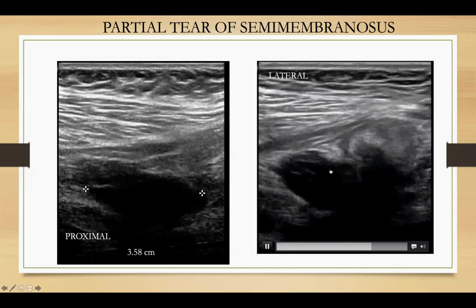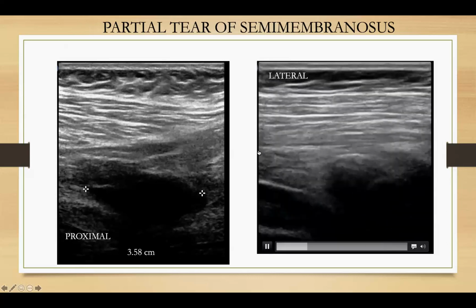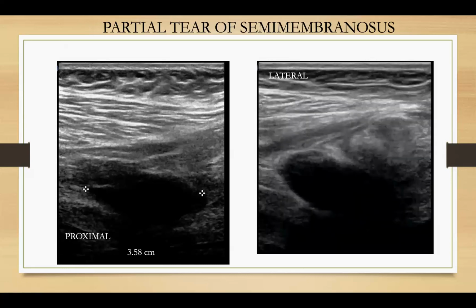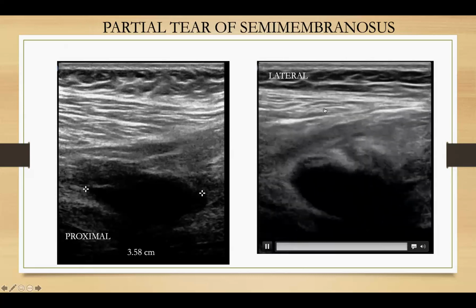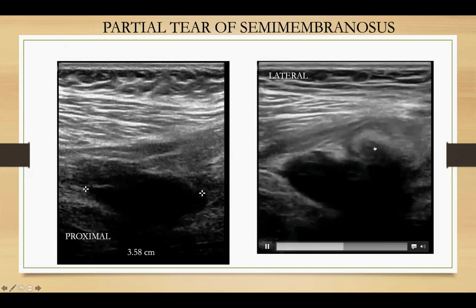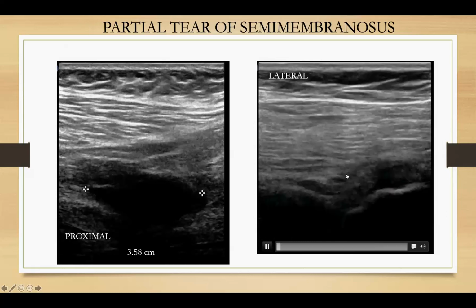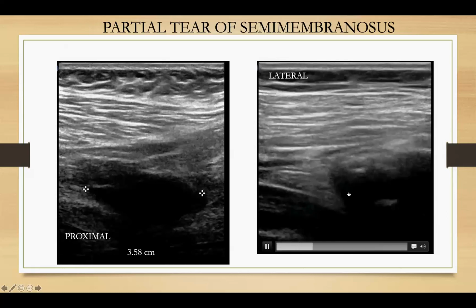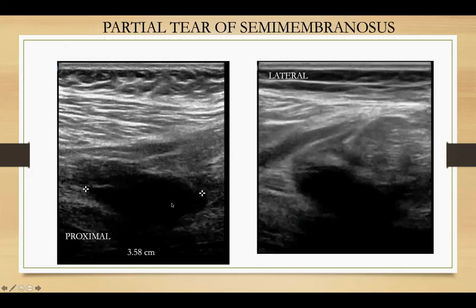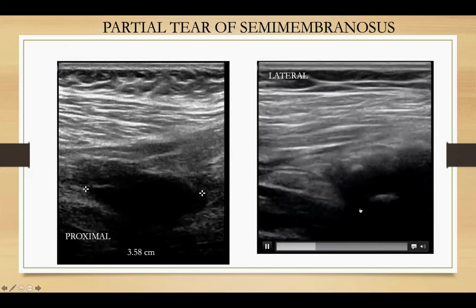This is the video of that. This is a short axis scan. Top is superficial, left is lateral, right will be medial. Here you have the overlying gluteus maximus muscle. There was ischium, the conjoint tendon and semimembranosus muscle here, or sorry, semitendinosus muscle. And then deep to the semitendinosus, you see this anechoic region develop here. And that is that same hematoma in the region where the semimembranosus tendon should be.